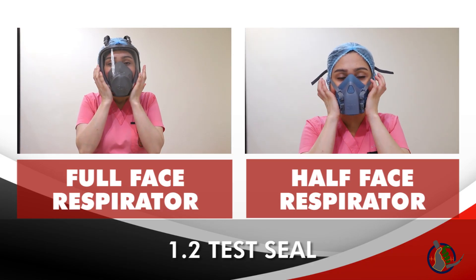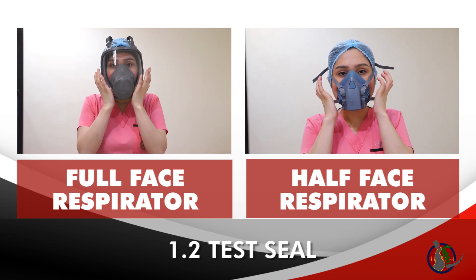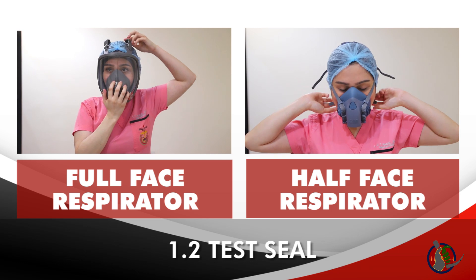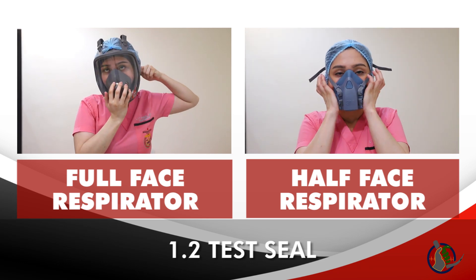With both palms of the hand, occlude both air inlets, then create negative pressure by doing short inspiratory breaths. This should pull the mask toward your face, indicating no leaks around the mask. If negative pressure is not achieved, readjust straps and reassess the seal.